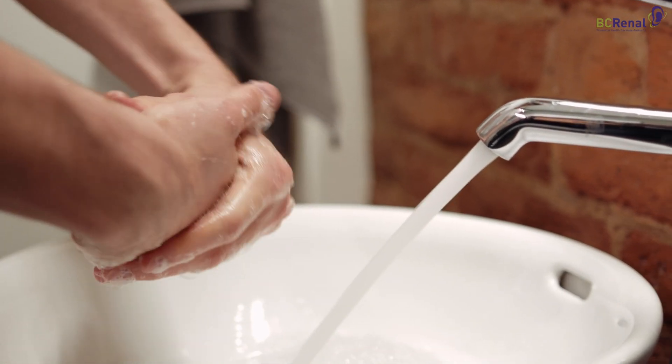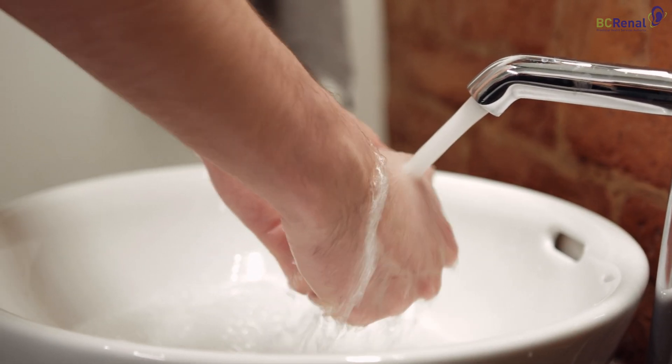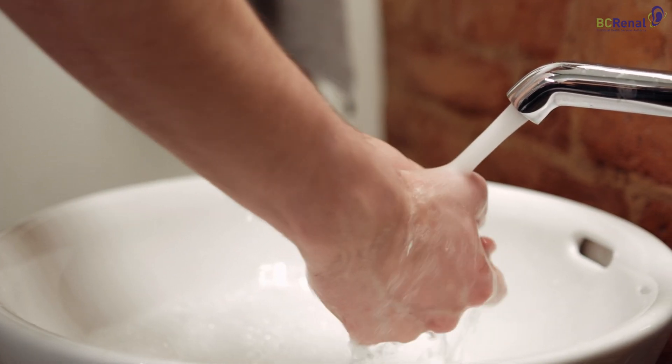The first step of any PD procedure is to wash your hands. Always remember to wash your hands with soap and water before setting up the Claria Cycler.